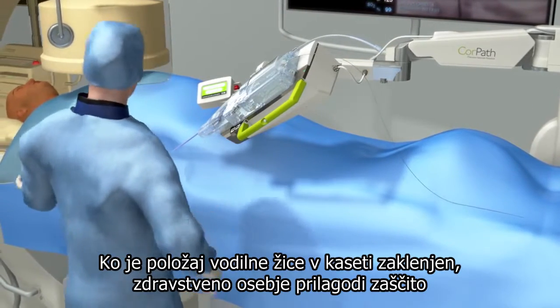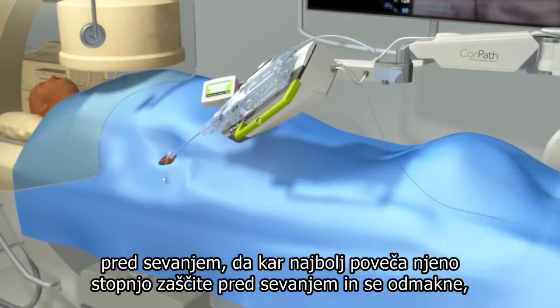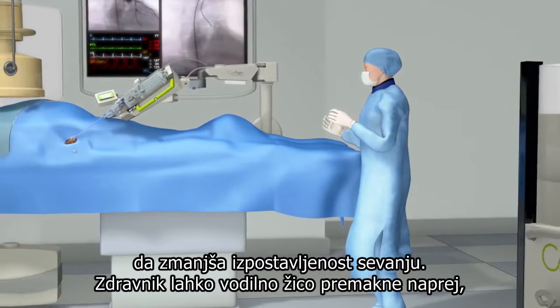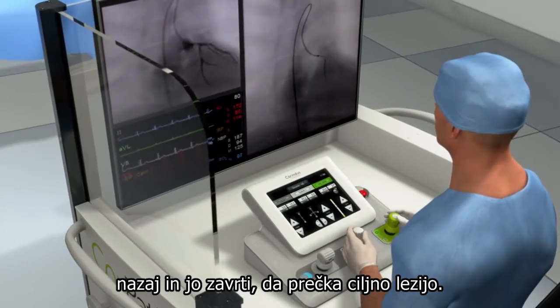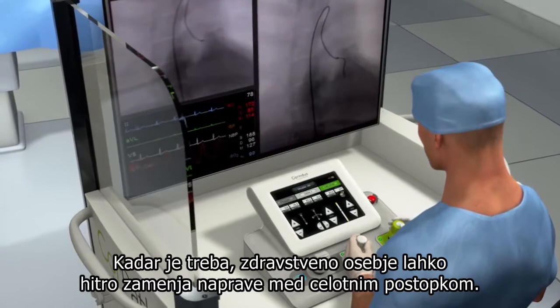With the guide wire position locked in place within the cassette, the Scrubs staff adjusts the radiation shield to maximize her radiation protection and steps away to minimize her radiation exposure. The physician can advance, retract, and rotate the guide wire in order to cross the targeted lesion. As necessary, devices can be quickly exchanged by the Scrubs staff throughout the procedure.